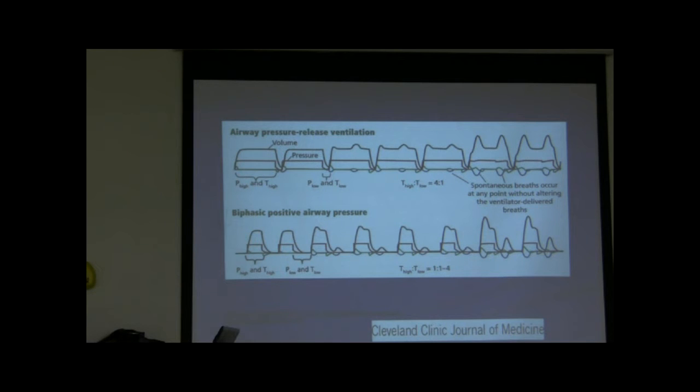And the reason I bring this up is that there are a lot of ways to manipulate how the breaths are given. And this particular mode is now gaining a lot more favor in certain subsets of hypoxia and respiratory failure patients, like ARDS patients. The patients who do not respond well to the traditional AC lung protection, you may think of something like this. So just keep in mind that there are different ways of giving the breath. Not just pushing in and taking it out, but dropping pressure and raising it back up. I know it may be a little confusing, but just so you're aware that sometimes you'll see that in the ICU.